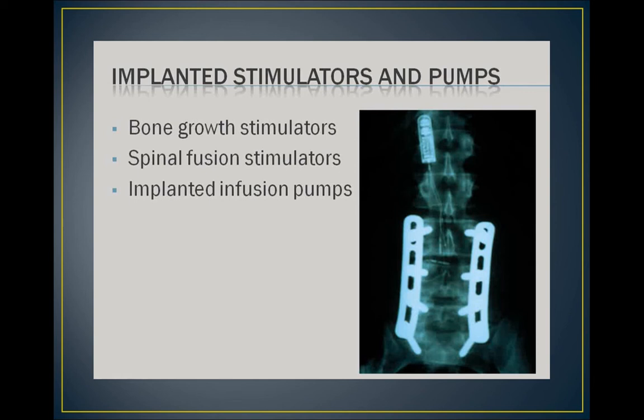Patients may also come to have an MRI and have an implanted drug infusion pump. Infusion pumps usually don't have leads or wires, just a plastic tube where the drug is delivered, but the pump itself needs to be checked for MRI compatibility. With external infusion pumps, the pumps may be removed and the plastic tubing left in the patient when the MRI is being done.